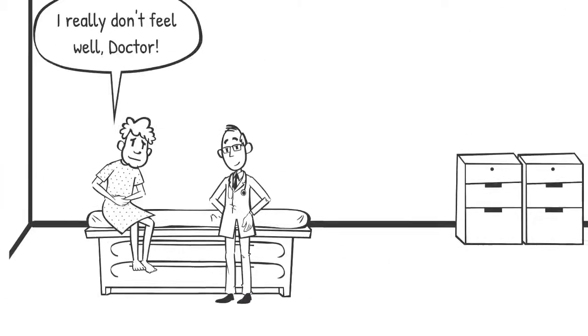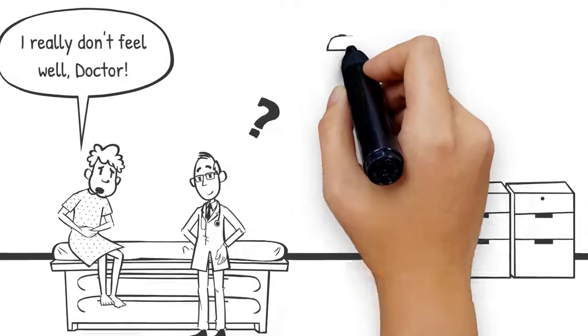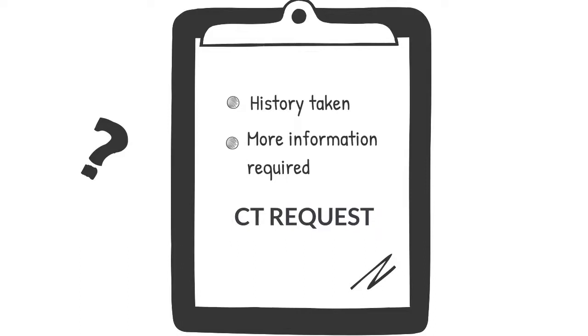You may be referred for a CT because you are feeling unwell, because your doctor wants to follow up some test results, or as part of a screening or research programme. You will have been referred for a CT because a healthcare professional who has reviewed your clinical history has decided that they need additional information that can be obtained by using a CT to look inside you.